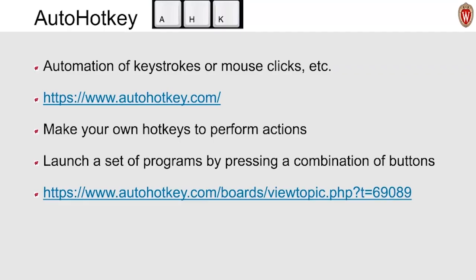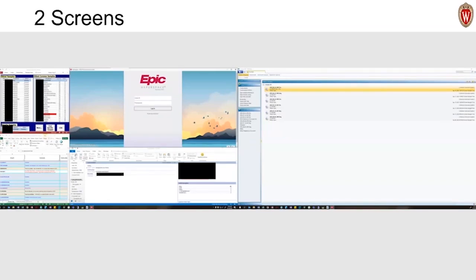Here's my 2-screen layout at work. I have my Unify open fully on one screen and the other screen split between our data reporting software, an Access database directing our quants, an Excel file that tells us how we handle different drugs when they're found, and my Outlook email and calendar.